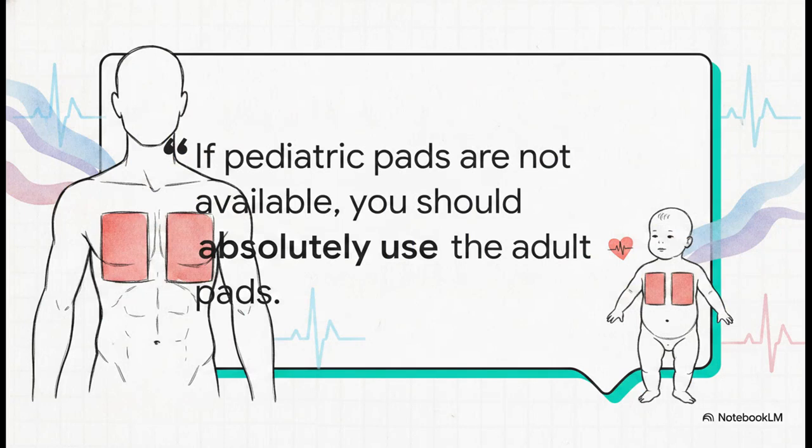But what happens if you only have adult pads available and you are suddenly faced with a pediatric emergency? Do you just do nothing? No. Expert guidelines are incredibly firm on this. You should absolutely use the standard adult pads on a child or infant. Yes, it delivers a stronger shock than is ideal, but hesitation can be fatal. Any shock is vastly better than no shock when you're dealing with a life-threatening heart rhythm.